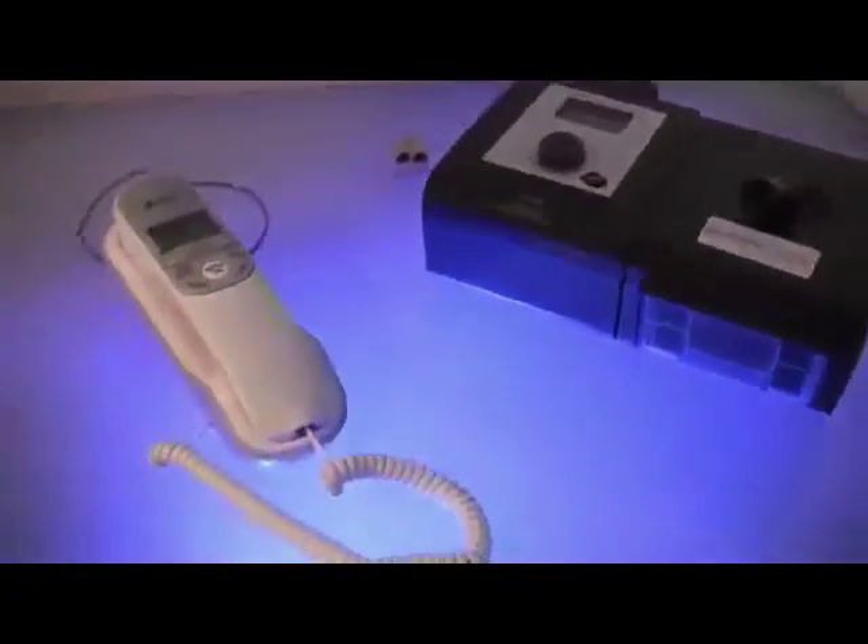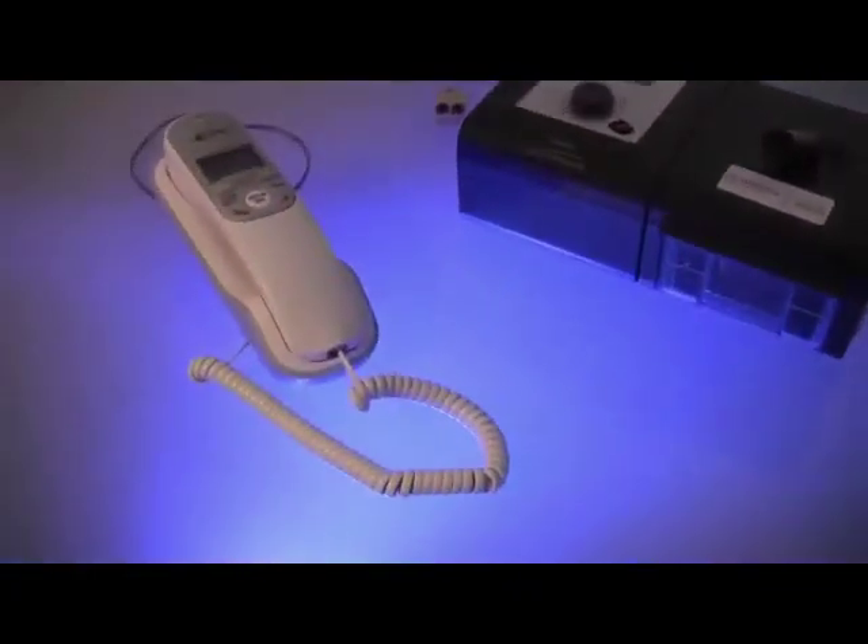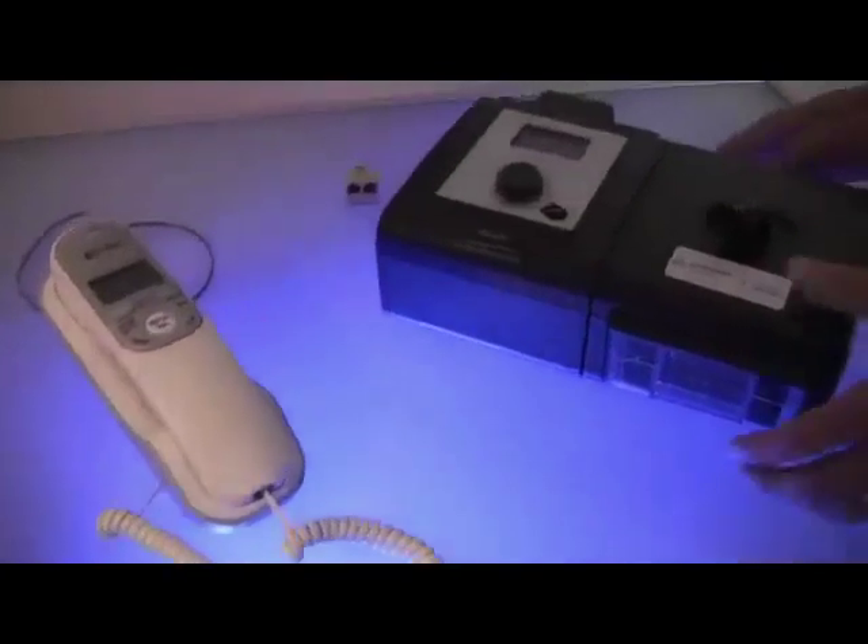This segment will explain how to connect your machine modem to your phone system. This educational video applies only to CPAP, auto, and BiPAP machines with supplied modem modules.